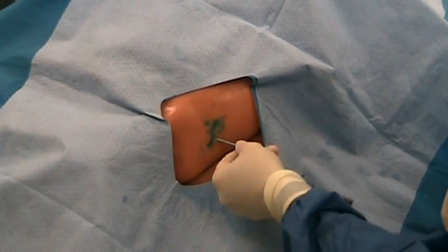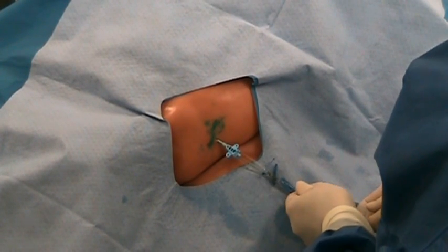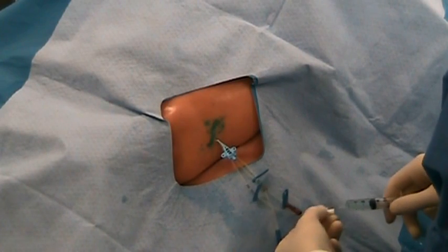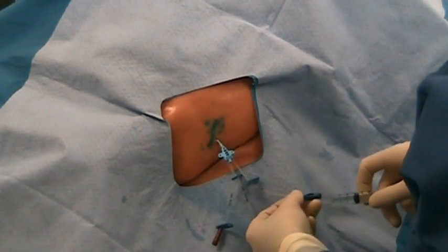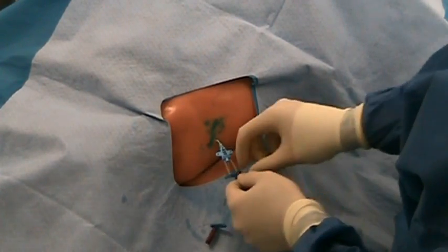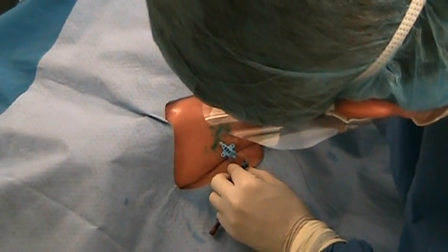Once the catheter is in place, the guide wire should be removed. Each port on the catheter should be aspirated and flushed with sterile saline. The catheter is now affixed in place using the included suture to suture the catheter clamp to the skin.